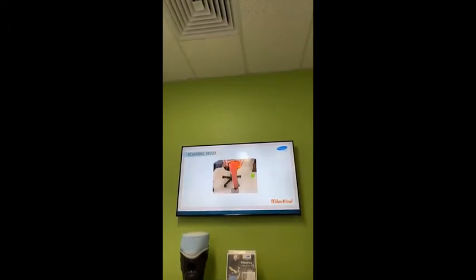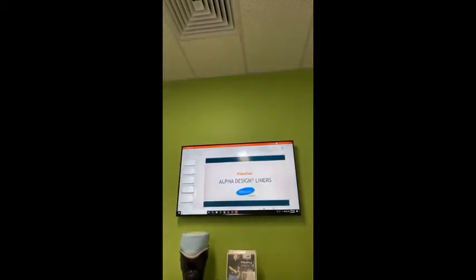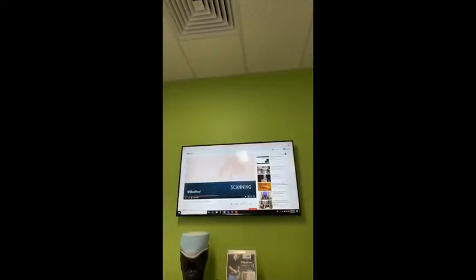So I'm just going to switch screens now, and we'll just go to a video, and I'll just see if this works. I've just got to minimize this, and then we can go to the video here.